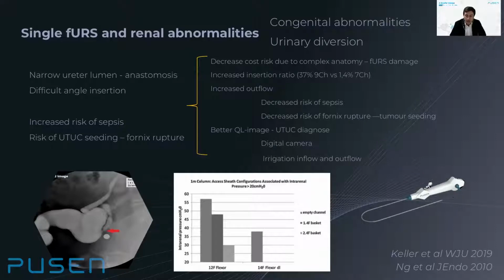And all this should ideally come with a better quality of vision using a digital camera. So the perfect flexible scope for treating those patients will be a single-use flexible scope with a small caliber.